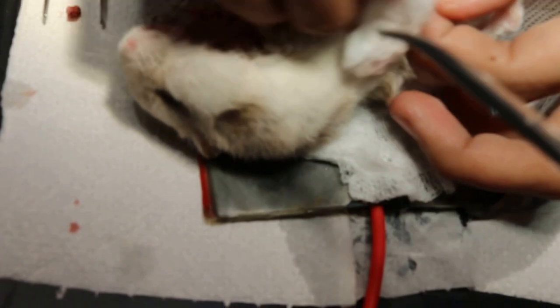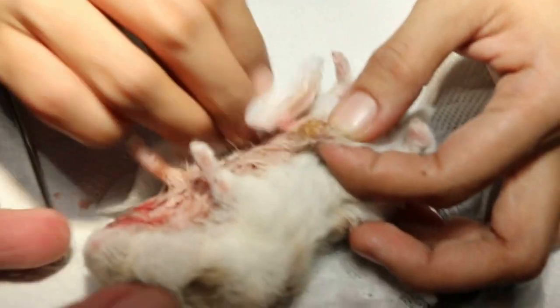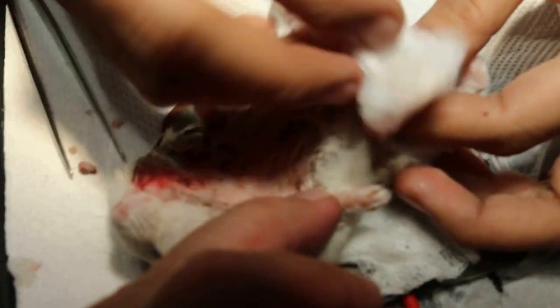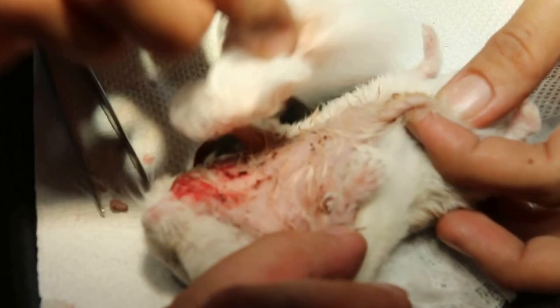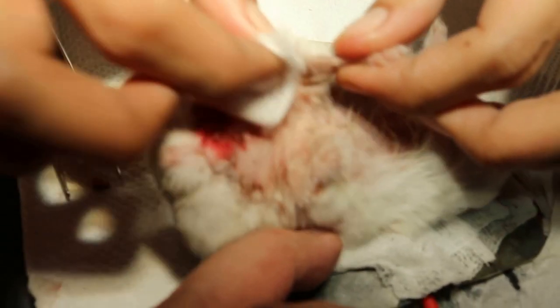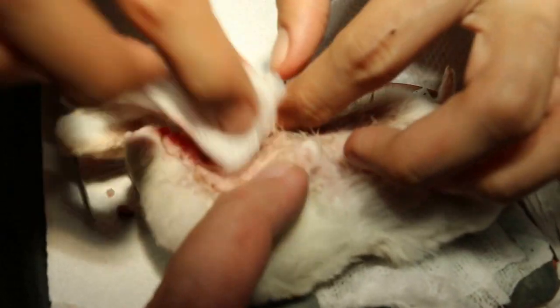Just clean up. Clean up before he wakes up, because this fellow is quite fat here. All these are bleeding areas. Come faster than that, you cannot take the time. Just like pinching the skin and just pulling up the blood clots here. Just want to clean up the bleeding.